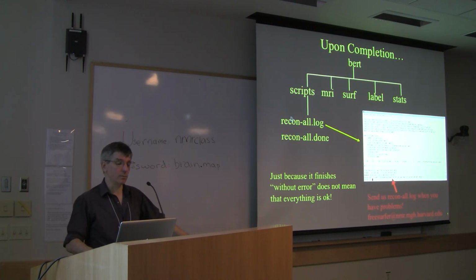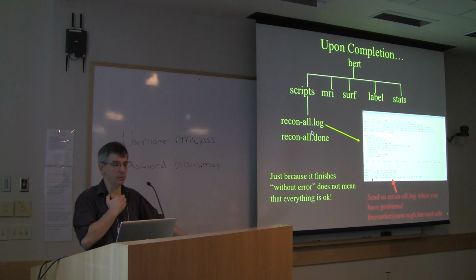So it's important that you know what this recon-all log file is and where it is, because if something fails, this is the single most useful element that you can send to us to help you debug the problem. At the end, it should hopefully say something like recon-all finished without error, and it gives you the time that it finished at.